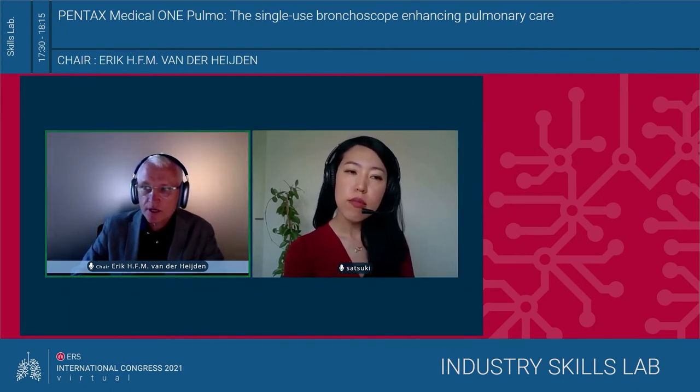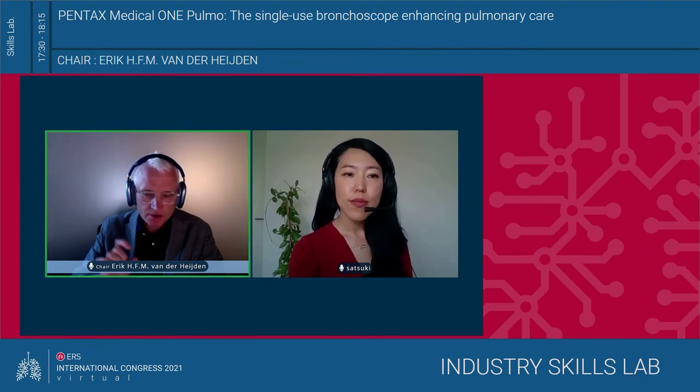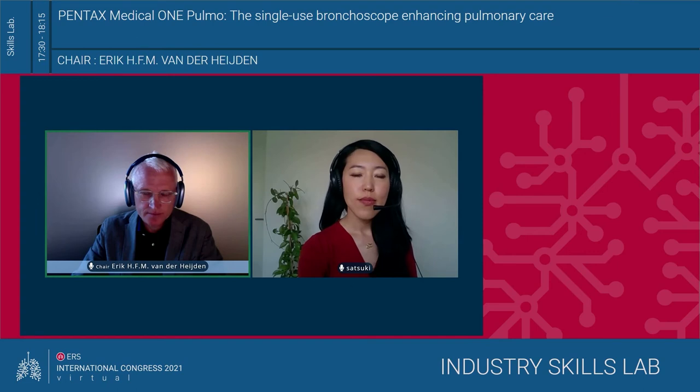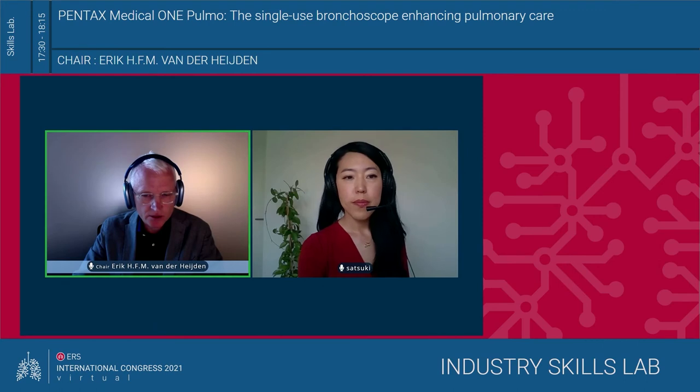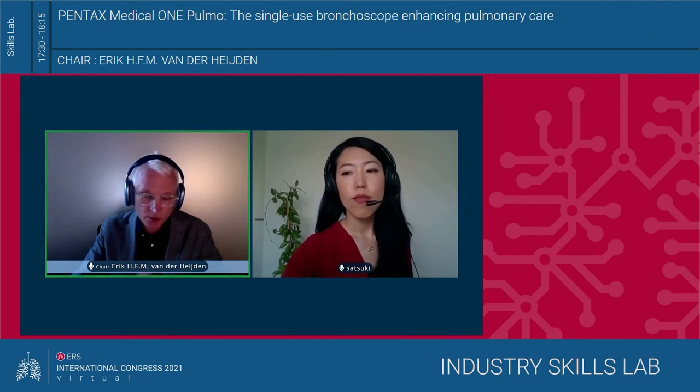So the lumen is a bit wider than the therapeutic scope. Normally I would have used the 19, which has the 2.8 millimeter working channel, and most of the instruments that we use have a 2.0 outer diameter. But the electrocautery snare that I use is a bit bigger, 2.3, 2.4, and then it's difficult to suction anything out. So this extra lumen allows you to have both suction and still maneuver and see what you want to do.